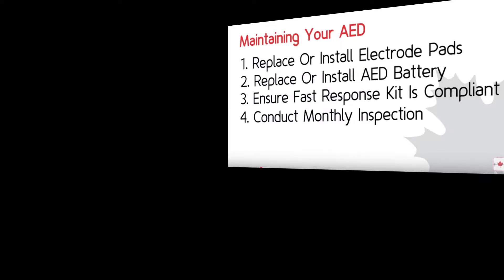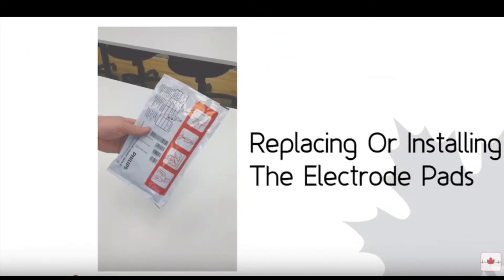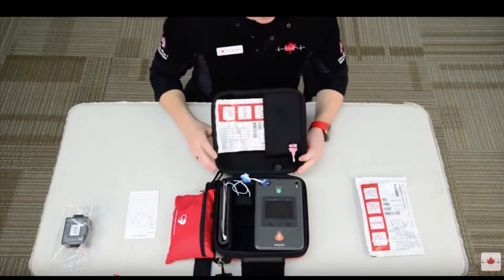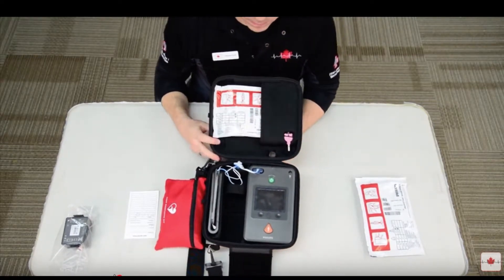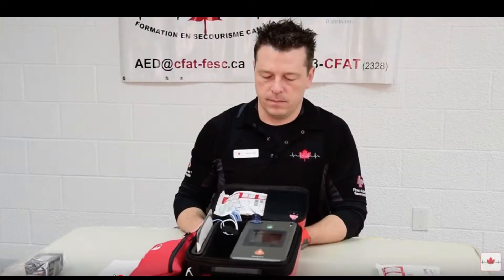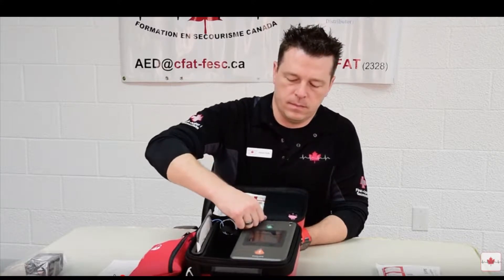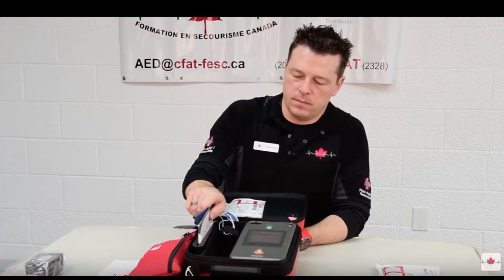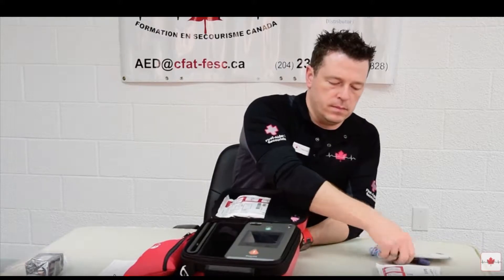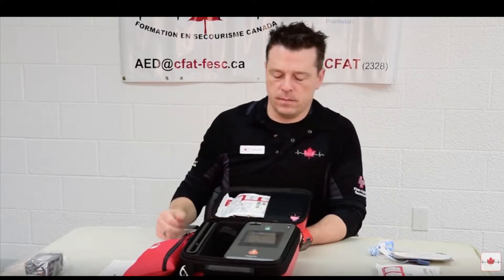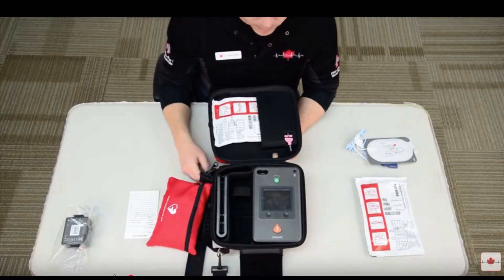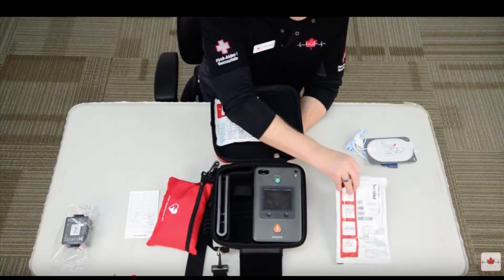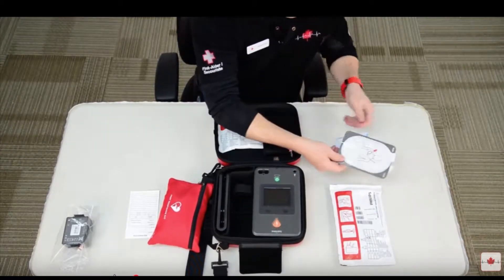Let's start with replacing the electrode pads. Open the hard case and undo the latch. Next, unplug the electrode pads from the top left of the AED and place the expired pads to the side. Once this is done, it's time to open the new set of electrode pads. Check the expiry dates on the aluminum packaging.